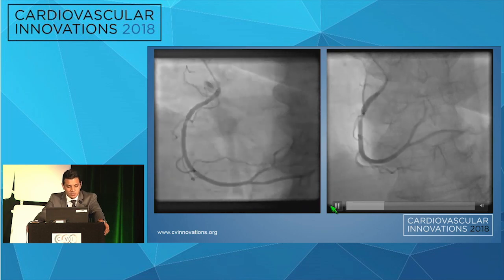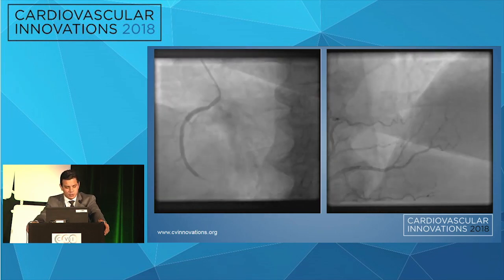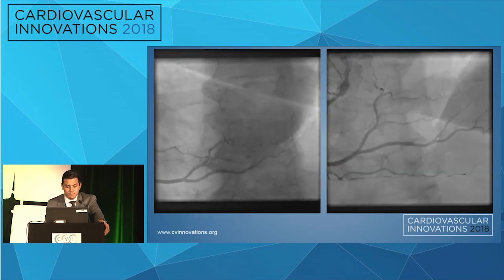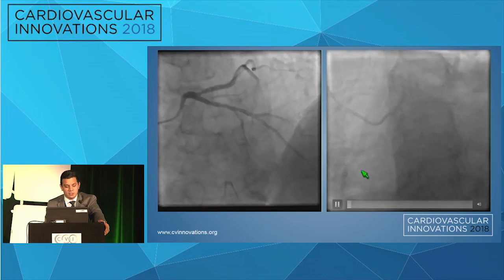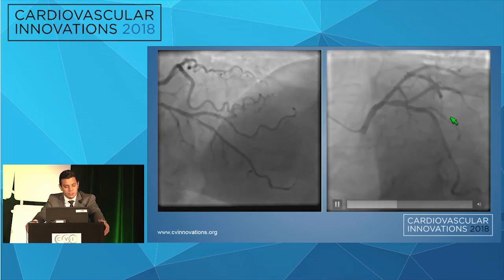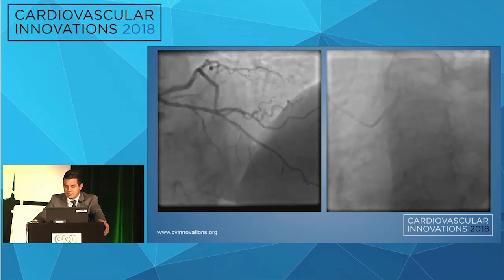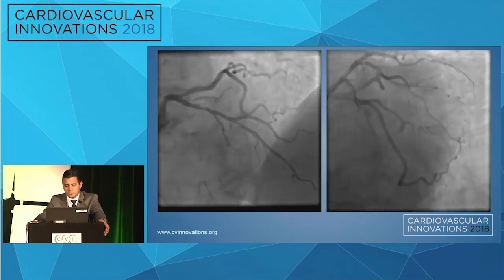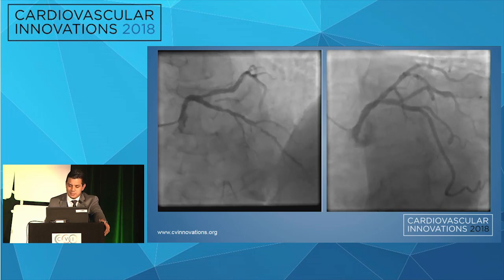This is right radial coronary angiography, and you can see here the right coronary artery with a lesion right where that marginal comes off. And this is the left coronary artery system. You can appreciate some diffuse disease in the proximal LAD. There is a mid LAD lesion right past that diagonal, and also there appears to be, a little bit foreshortened, at least intermediate ostial proximal circumflex disease.